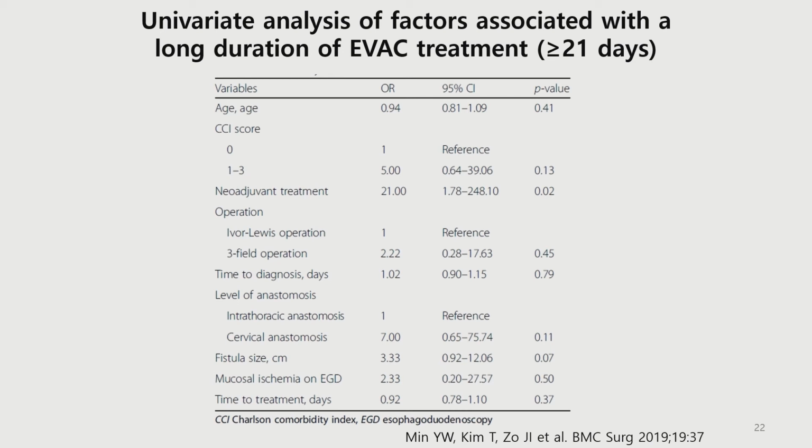Because we have only one treatment failure case, we could not identify the prognostic factor for failure. Instead, we investigated the factors associated with the long duration of endoscopy vacuum treatment. As you can see here, longer endoscopy vacuum treatment was required in patients who received neoadjuvant treatment. In addition, fistula size was associated with the treatment duration with marginal statistical significance.